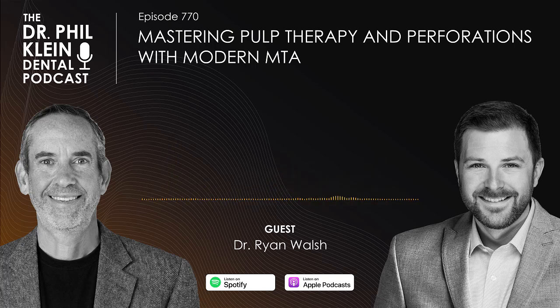We're now using radiopacifiers such as tantalite or zirconia that don't stain. Look out for materials that contain bismuth or bismuth oxide because they're going to discolor the tooth over time. So if you can stay with one that's non-staining, with tantalum or zirconia, you're going to be ahead of the game. Many, like we've mentioned a few times, have shorter setting times, shorter setting reactions, but also better handling. The smaller particle size makes for a really easy, packable, smooth material. It's not like you're packing pebbles into the canals.